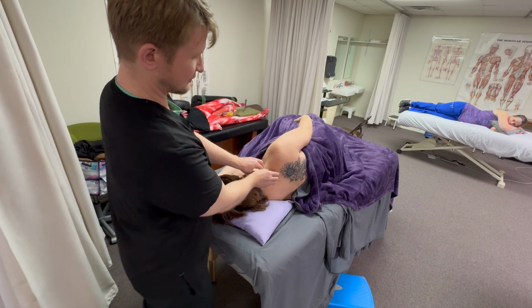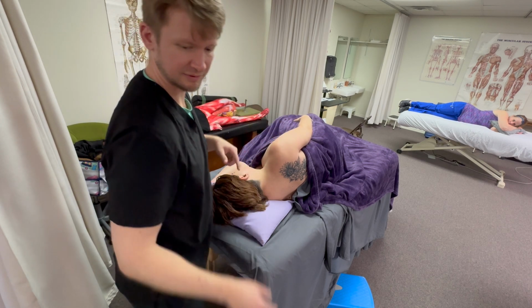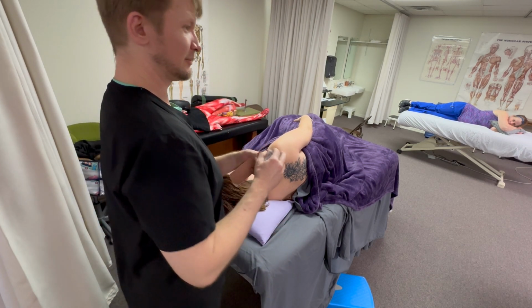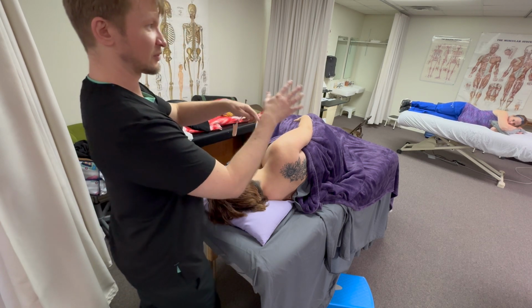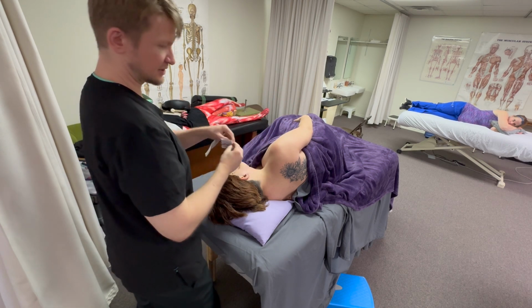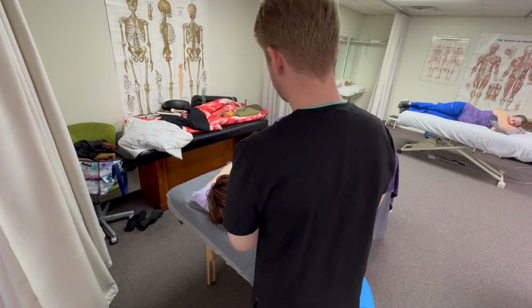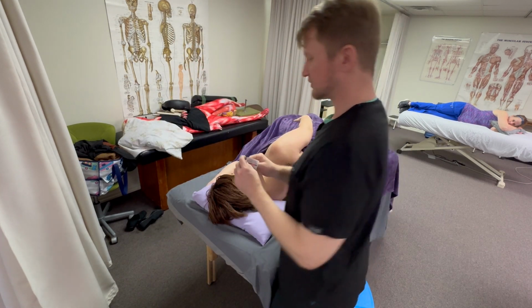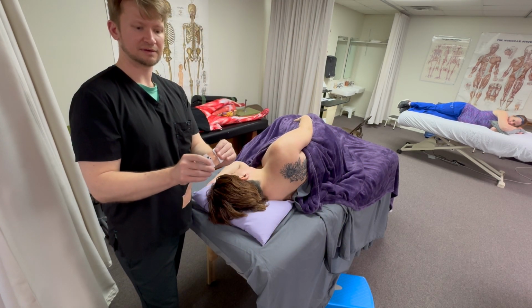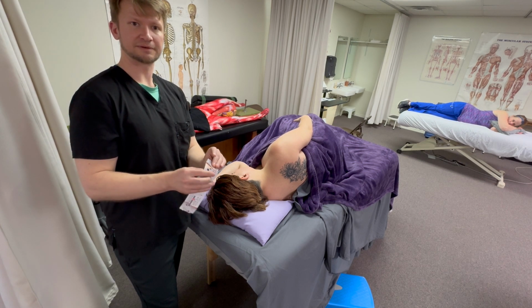So I have to make it start here and then come around and then line up more directly with deltoid. There's not a straight line in the human body, and that's how it was designed, and it's a good thing, but that's where you're sometimes having to make small adjustments, little curves and S shapes. So I'm going to get one anchor down, myself positioned. I tend to peel back the anchor halfway so I can just get this part stuck and then pull the rest of it.